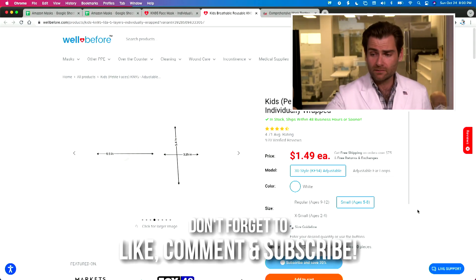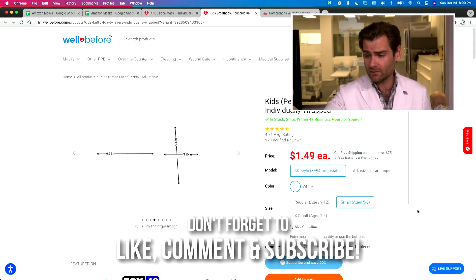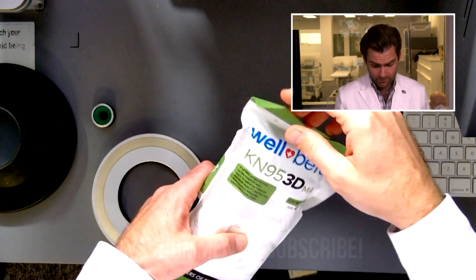Hey everyone, welcome back. We're testing every single mask we can get our hands on. Today we're looking at the Well Before brand of masks, especially their kids masks. Let's open this up and put it in the clamper.